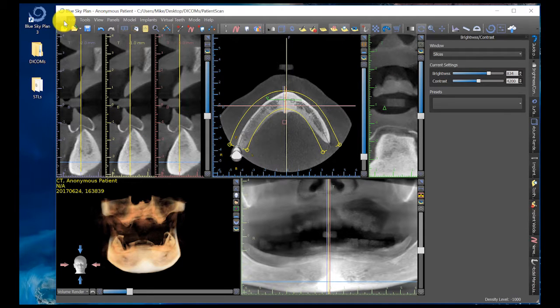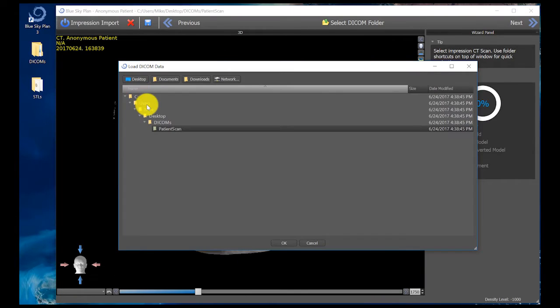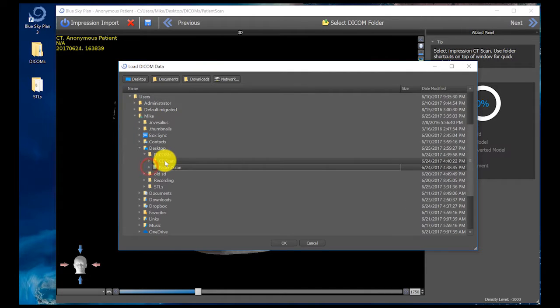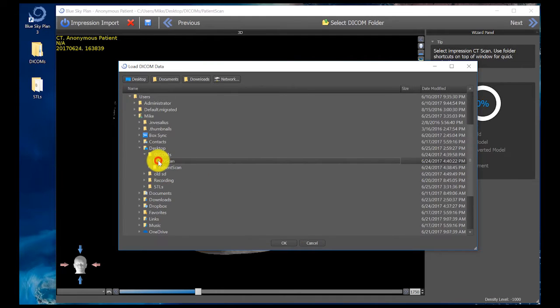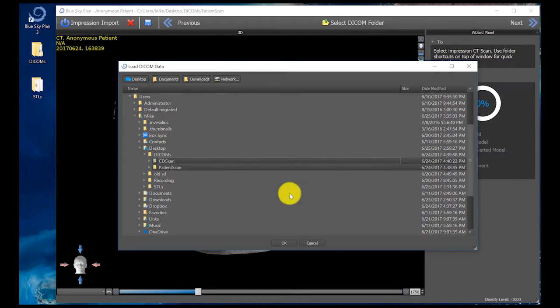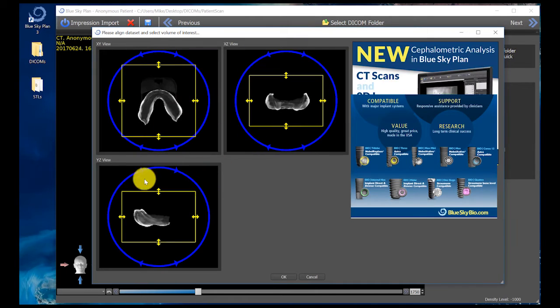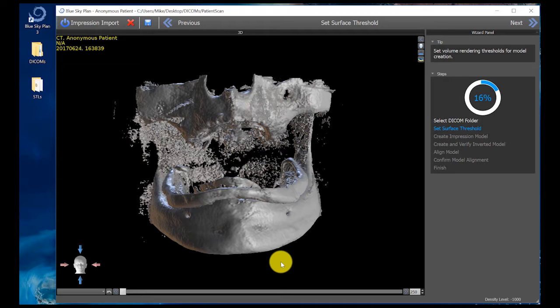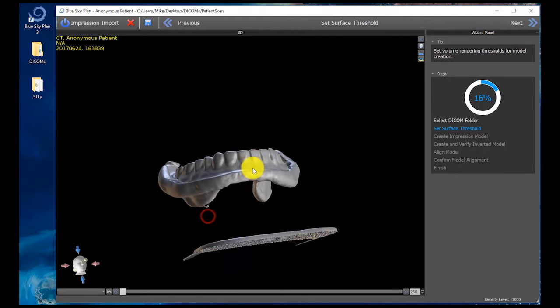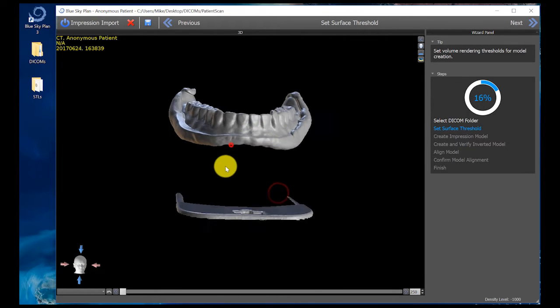The first step is to go to File, Import DICOMs, Impression Scan. Since we've made a radio opaque PVS impression, I need to use the Load DICOM Impression Scan function of the software. Click on the patient's folder with the files from the CBCT scan of the patient's denture in radio opaque PVS and click OK. The computer takes a minute to think and it'll bring up the scan of the patient's denture. Click OK and the computer thinks for a moment.